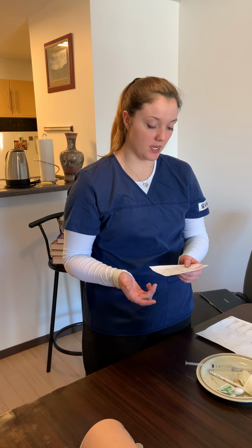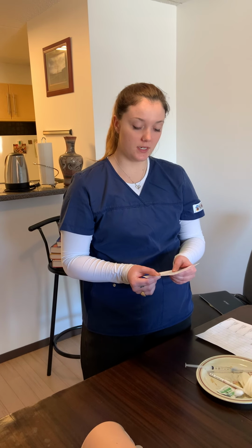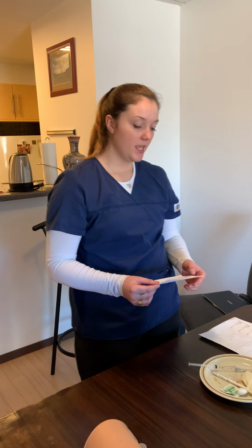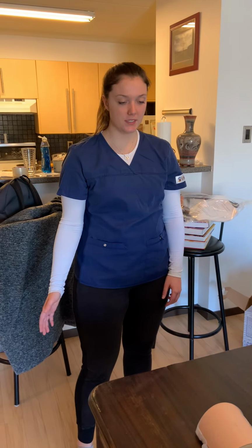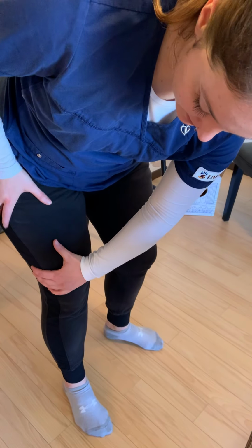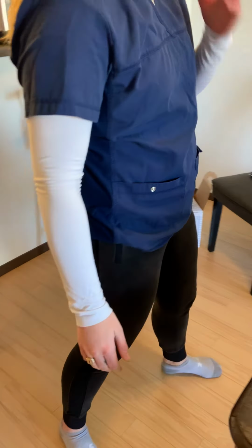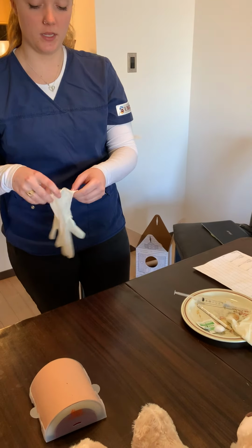Before I give this medication, I have already assessed for their nausea and vomiting, which they are experiencing, and any hypersensitivity, as well as their hepatic function and QT interval prolongation on the ECG. Now I'm going to landmark the site, and the site I'm using is the vastus lateralis. I'll put one hand on the greater trochanter, the other on the superior aspect of the knee, and then I'll close my hands, and right in this middle area on the lateral anterior aspect of the thigh is where I'll be giving it. Now I will wash my hands and put on my gloves.